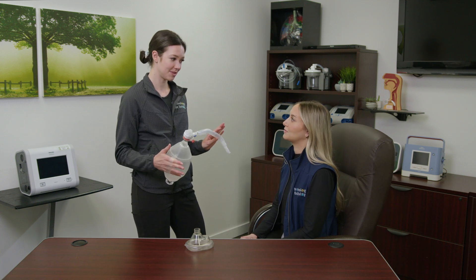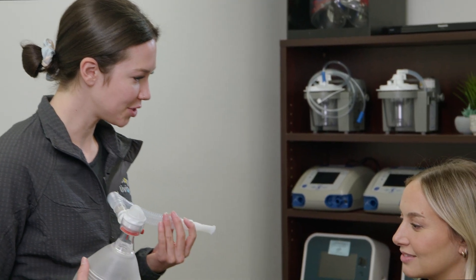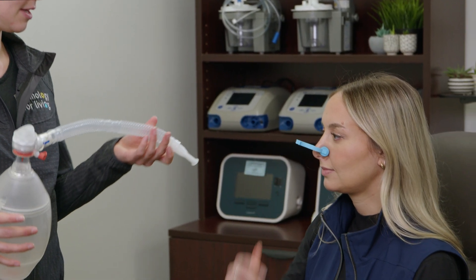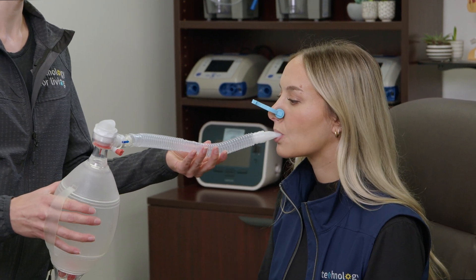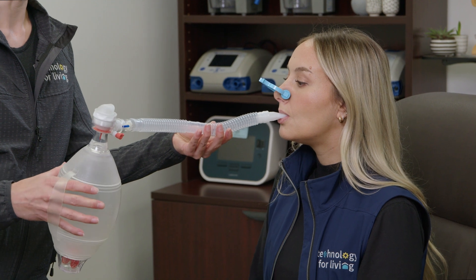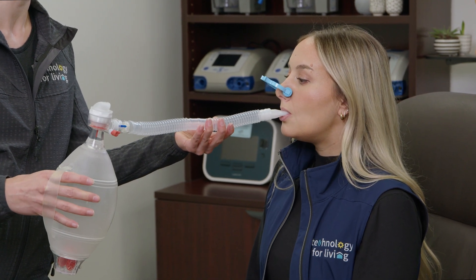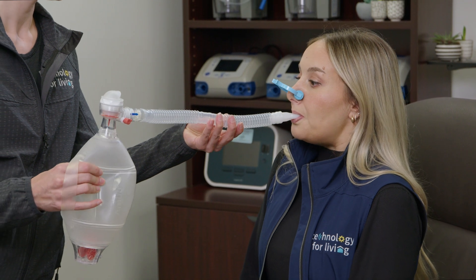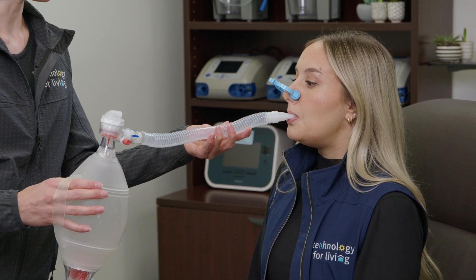Go ahead and put your nose clips on, and insert the mouthpiece between your teeth and your lips — make a nice tight seal. On three each time: one, two, three — hold. One, two, three — hold. One, two, three. Hold for 10 seconds, then remove the mouthpiece and breathe out.